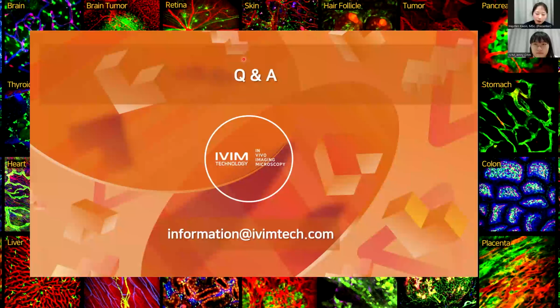Yes, I know where you're coming from. To address this limitation, we could use other normal animal models like B6 wild type or other white wild type mice. In this case, we have the specific labeling kit to label the T cells located inside of the living body. So we could label the cells with various colors or fluorophores excited with different wavelengths of the laser. So you could get the same result or the wonderful imaging data like I showed you in this webinar.